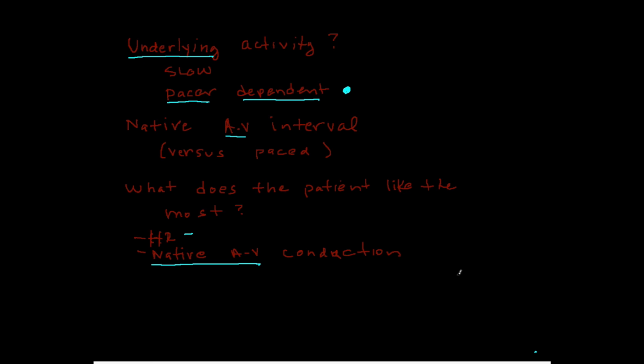There's no textbook answer to any of these questions. You have to individualize therapy. It depends on the patient's heart morphology, thickness, what's going on with them, what the nature of the surgery is, other characteristics of the heart. So hopefully that'll give you a few pointers to get you started.